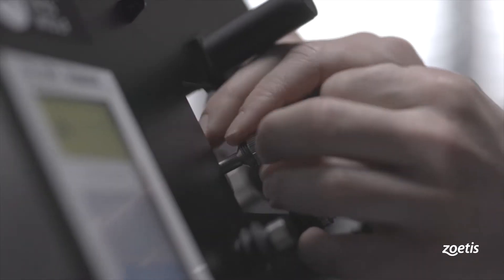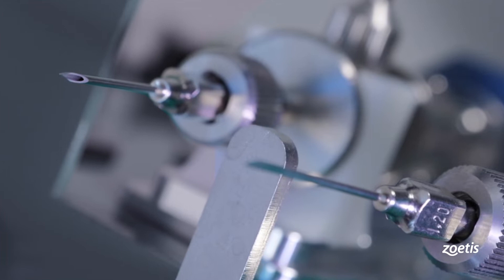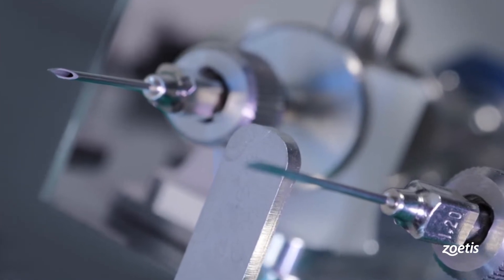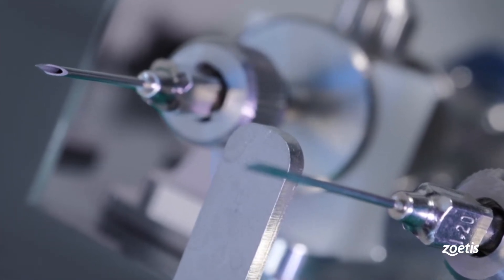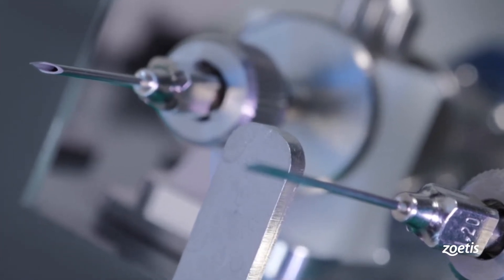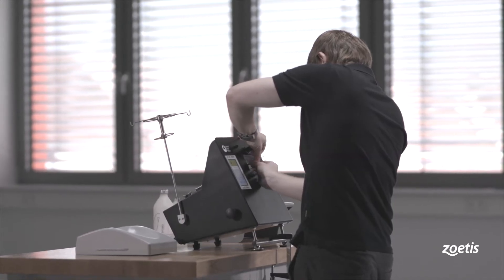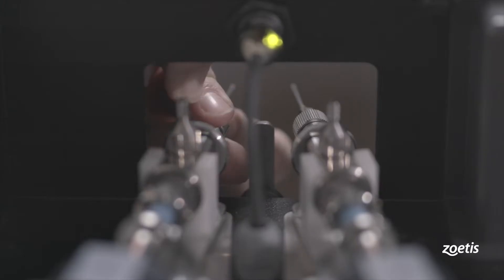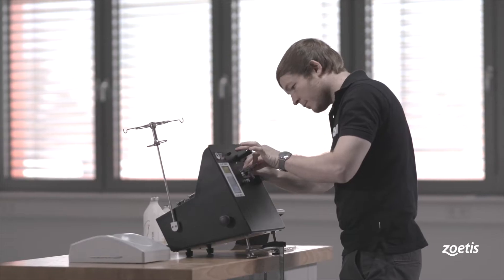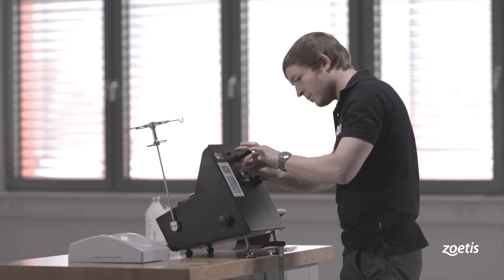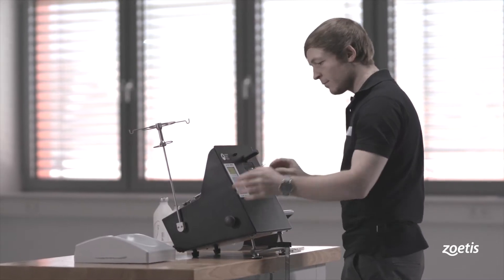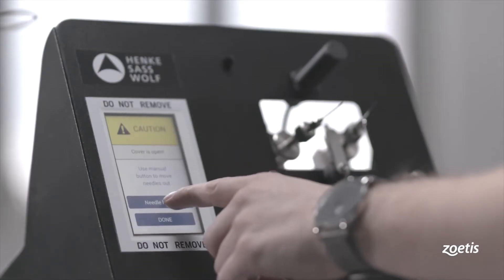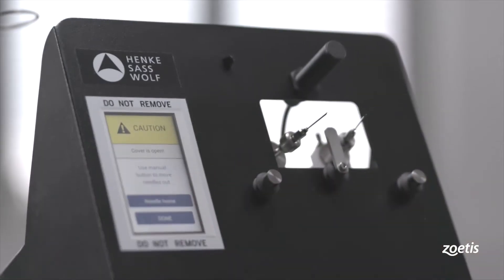Align the needle nut so that the long side of the tip is facing to the outside of the device. Repeat the needle installation on the second syringe. On the display, touch Needle Home to retract the syringes into the machine.